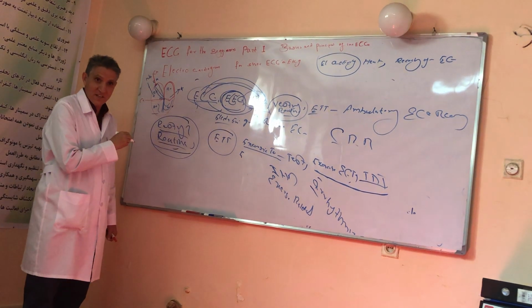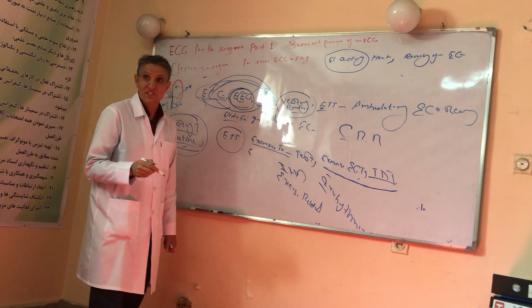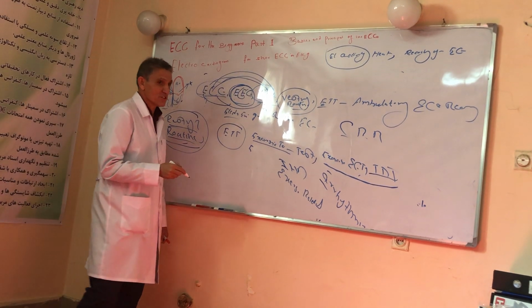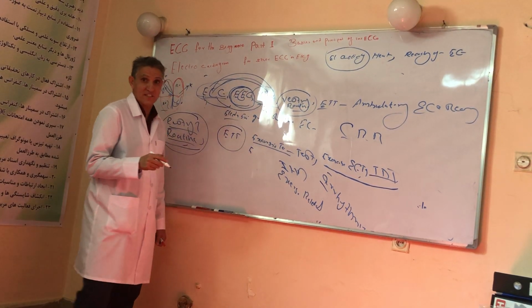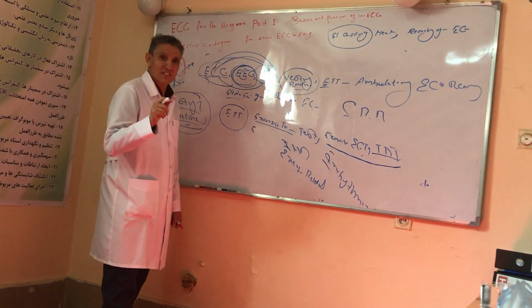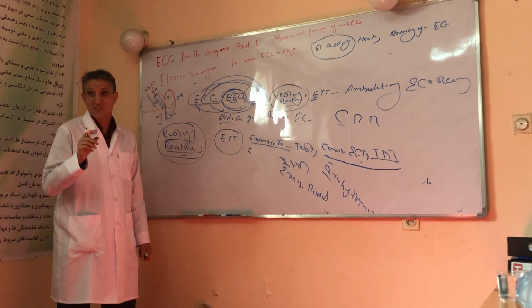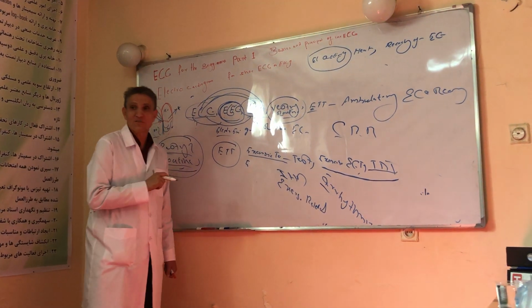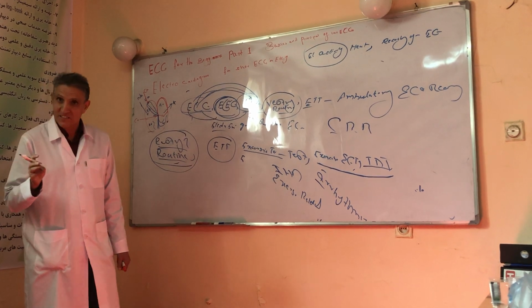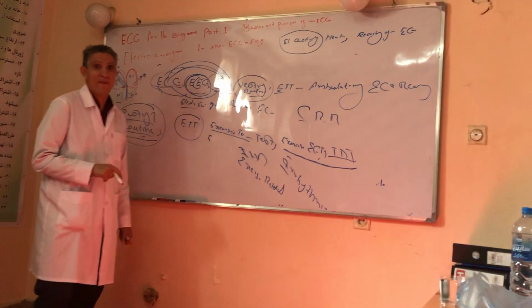So in contrast to the routine ECG, ETT is not a simple test. Two people must be present to monitor the patient and perform CPR. Second, in addition to these two people, there are some drugs and equipment which are necessary for CPR.